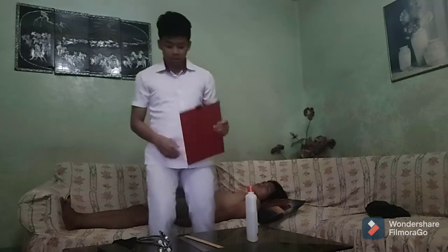Next is to have the patient hold breath and auscultate the carotid with the bell portion of the stethoscope for bruits. Auscultation is very useful in assessing heart sounds and vascular sounds. It is used extensively in the cardiovascular assessment to evaluate cardiac function.